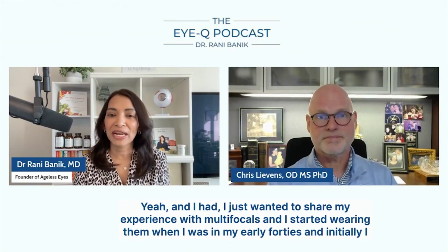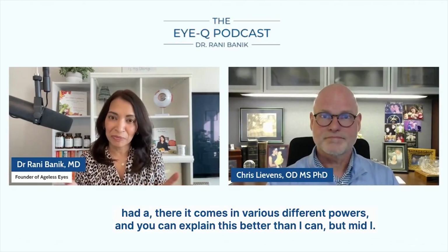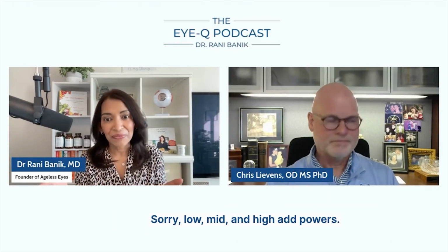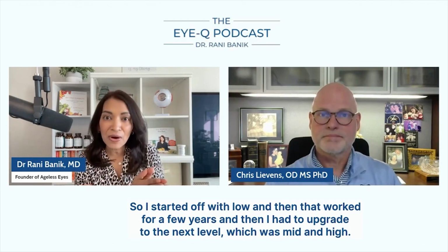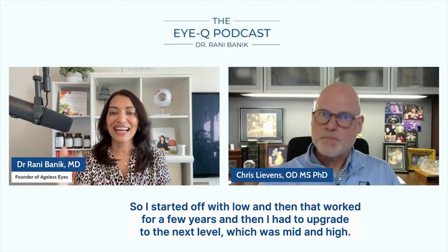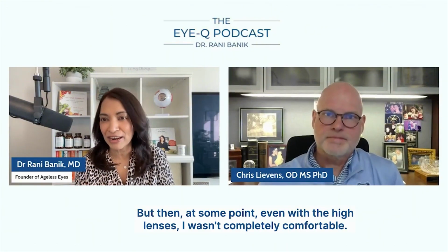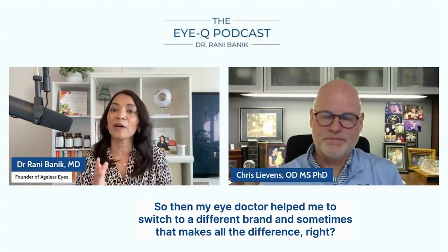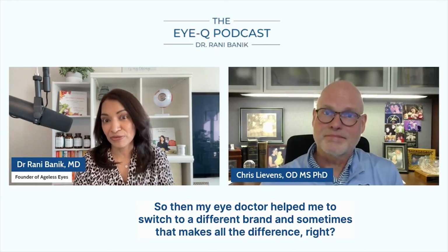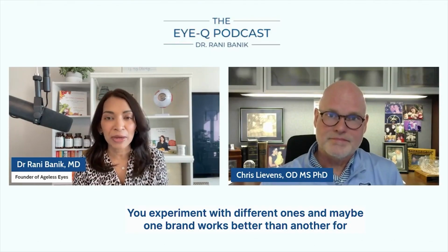And I started wearing them when I was in my early 40s. And initially it comes in various different powers, and you can explain this better than I can, but low, mid, and high add powers. So I started off with low, and then that worked for a few years. And then I had to upgrade to the next level, which was mid and high. But then at some point, even with the high lenses, I wasn't completely comfortable. So then my eye doctor helped me to switch to a different brand. And sometimes that makes all the difference, right? When you experiment with different ones, and maybe one brand works better than another.